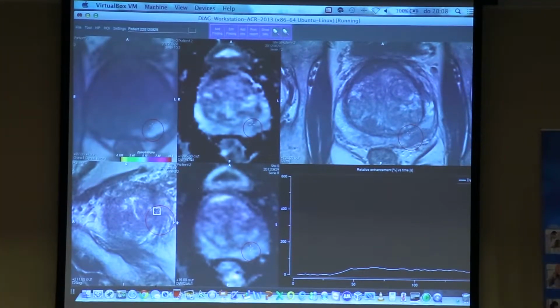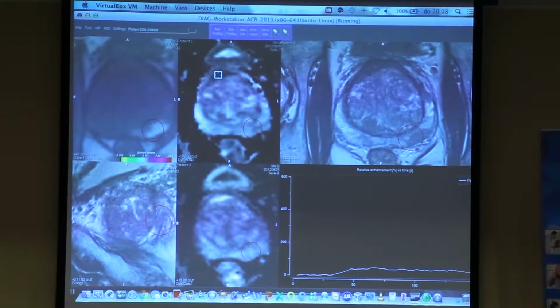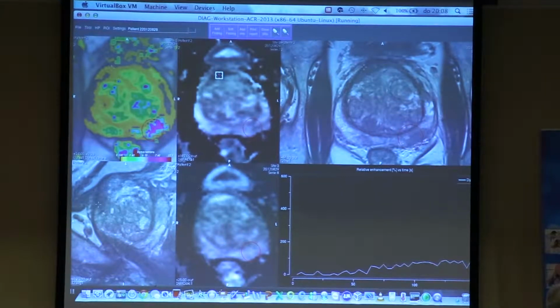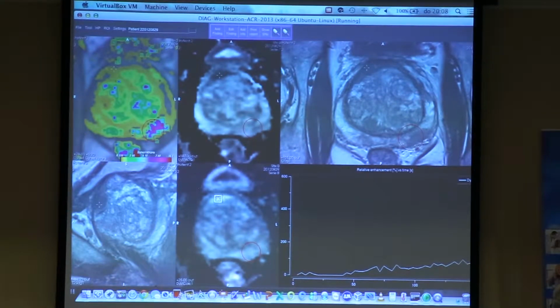It's fine to look where people miss, so you always look out. I feel in the anterior right there. That's black. Okay. Black. You want to know the value? Black. Yeah. It's going to have a low ADC value. The value is 600, it's even 590. Yes, that's too low. It's below 950. That's a 5. Okay, and here?